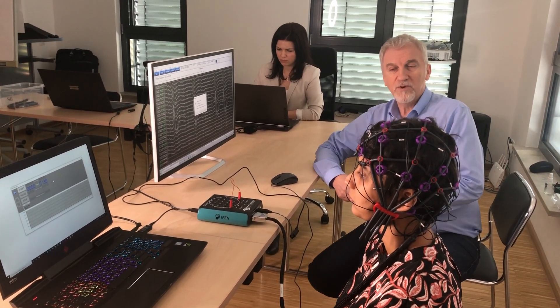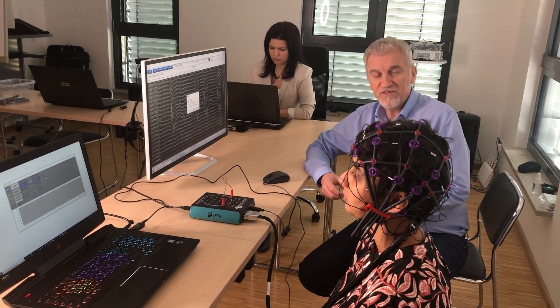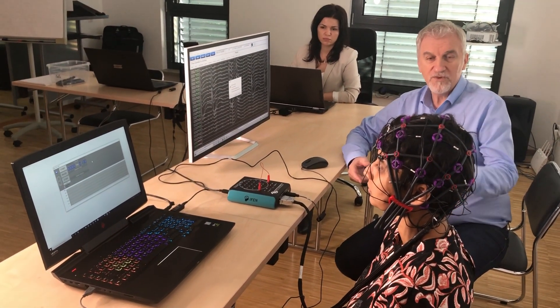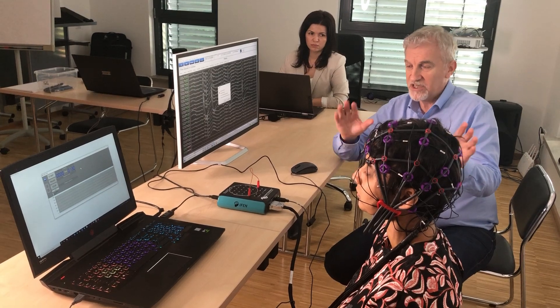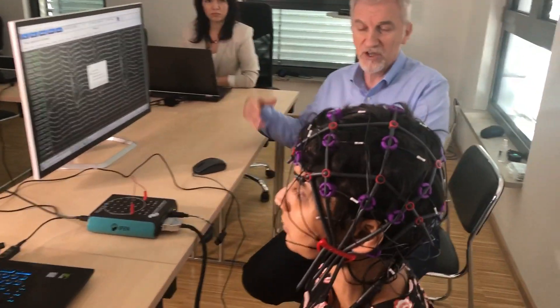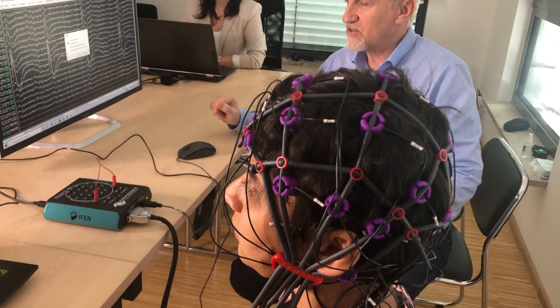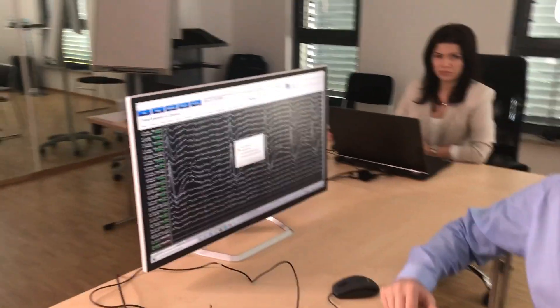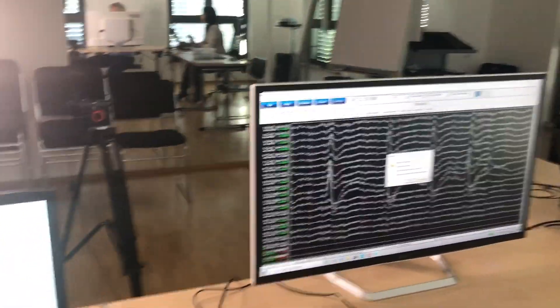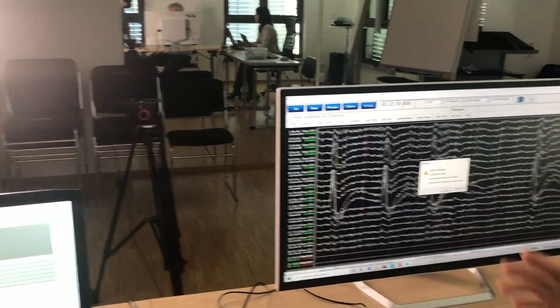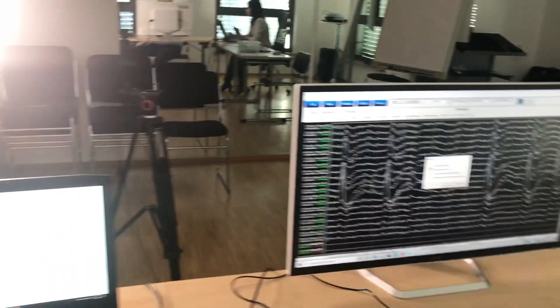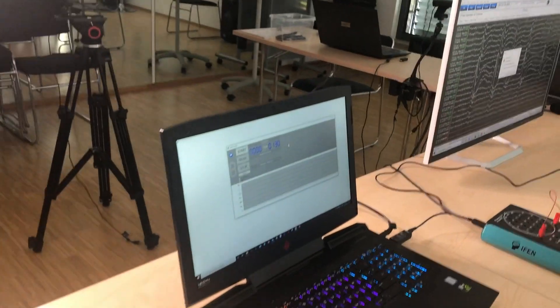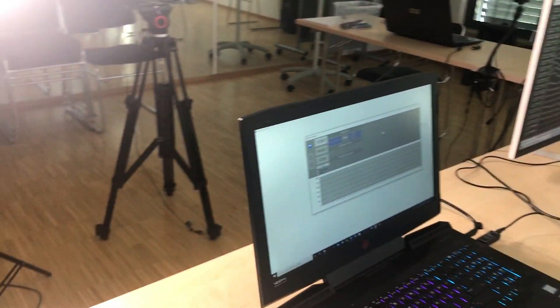I'm showing you now how to run a simple ERP test, the P300. What we need to start with: we have an EEG cap, we have the EEG set up, it's already running — just to show that the EEG is good, that we have a good and nice signal, and the impedances are good, kept below 10 kilo-ohm. And here we have the stimulus presentation program, which is our development from the IFEN, it's called Capito, and it will present the stimuli.